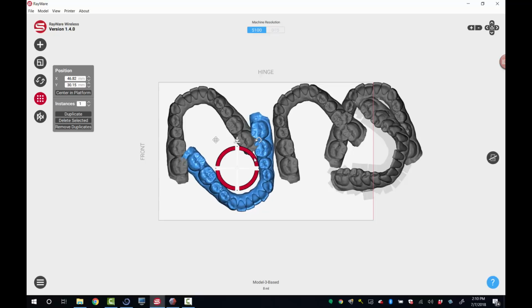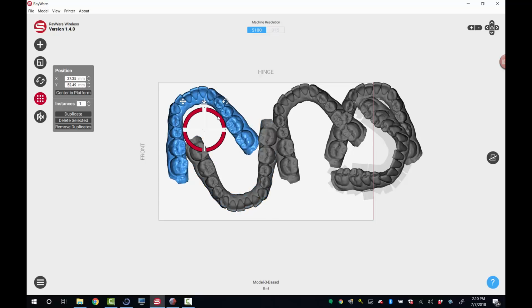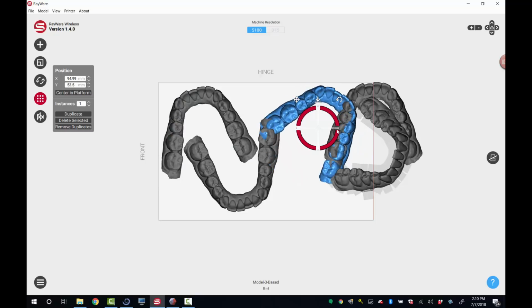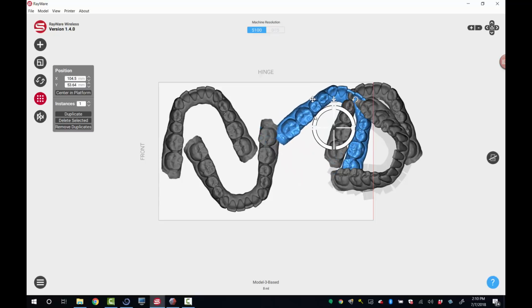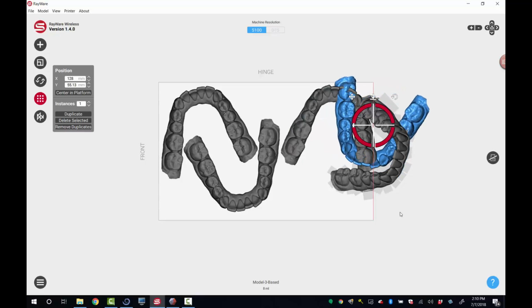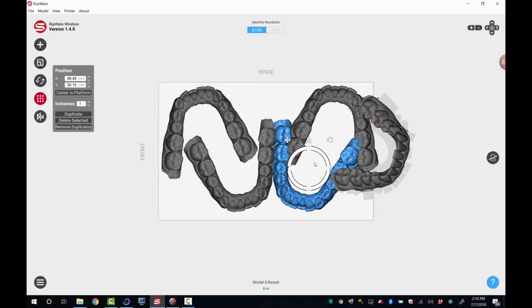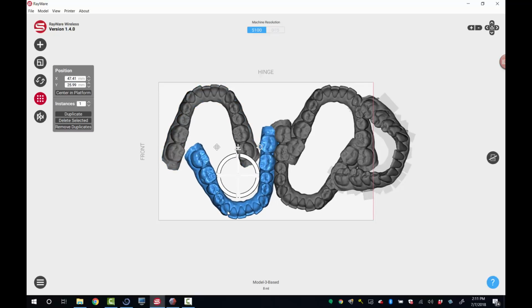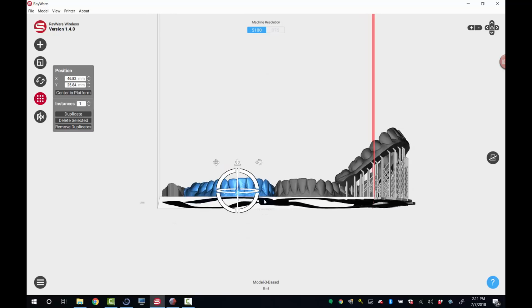Yeah, it might be tight to fit 4, just by the arch dimension, but again, I could probably spend some more time and maybe finagle 4 on here. But this is all about printing speed at this point. You print horizontal if you need to print models really quickly, because the height is so short.